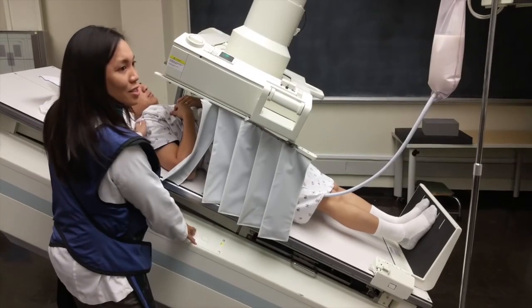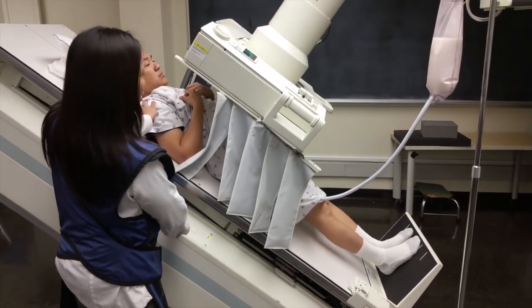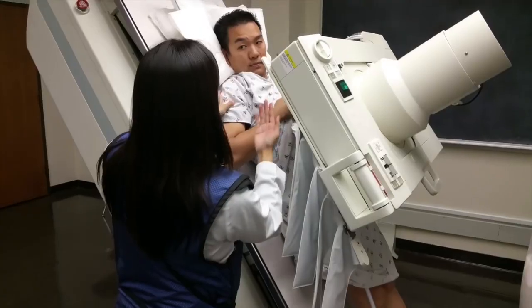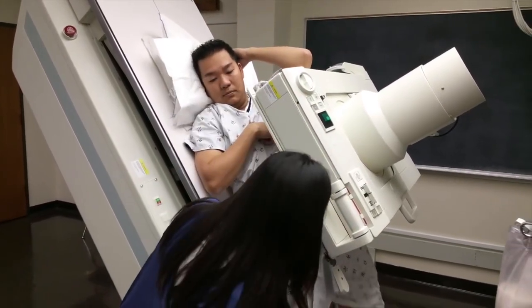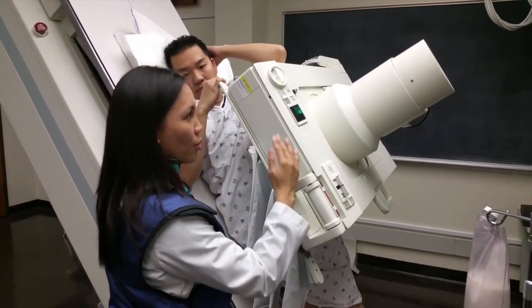The table can be tilted upright to clear the barium pool and allow the flexures and transverse colon to distend. I usually place my hand on the patient's shoulder and ask them to steady their feet while I slowly raise the table to take good air contrast spot images of the flexures and transverse colon.